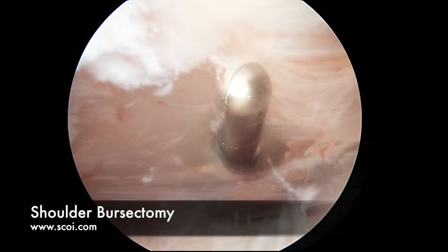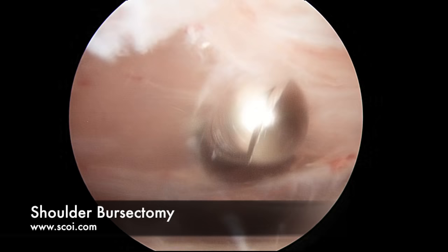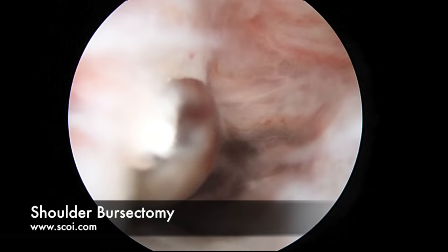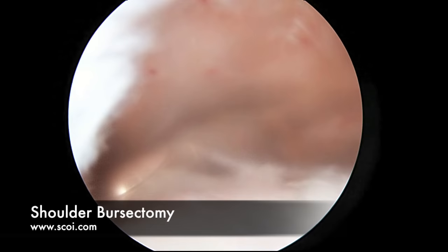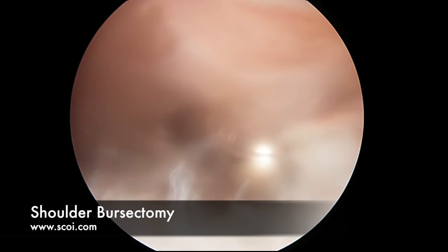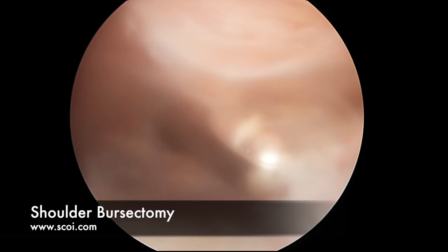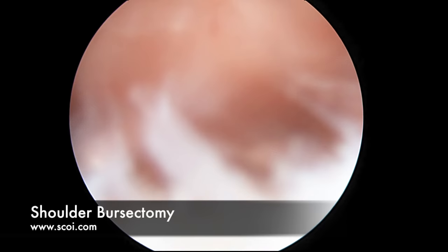This is what we call an arthroscopic shaver — it has an oscillating blade and some suction, similar to a Dremel type device. We can control by controlling the suction how much of the bursitis and tissue comes into the jaws to be removed. This is only about 5.5mm wide, although on these cameras it looks much wider. You'll see as we debride the bursitis it bleeds a little bit — it has some blood supply and some nerve supply. We can smooth it out like so. This is what we call a bursectomy.